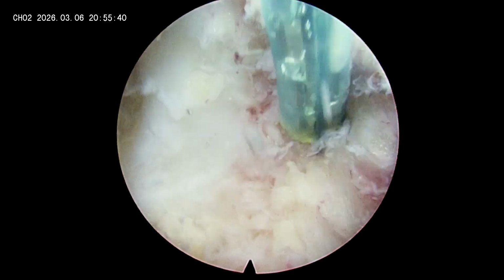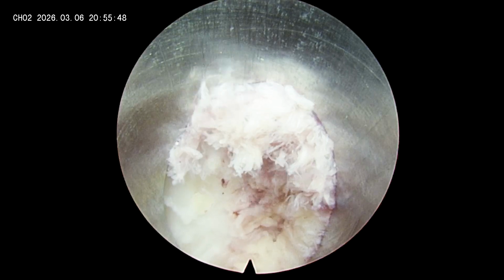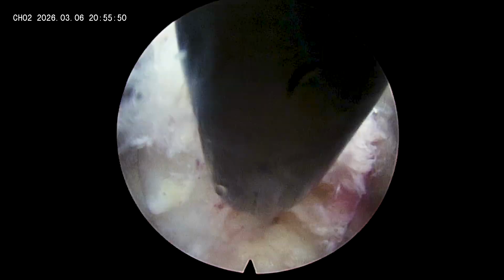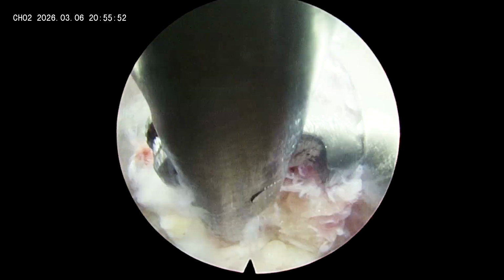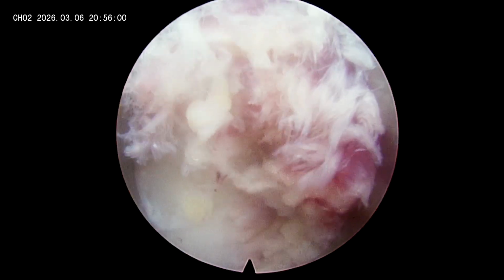Now we are trying to identify the landmarks here. Superiorly I am going to identify the superior lamina. You can see here I am already over the bone. This is nothing but the bone. So I have identified the superior lamina here. I am just removing more soft tissues from here.